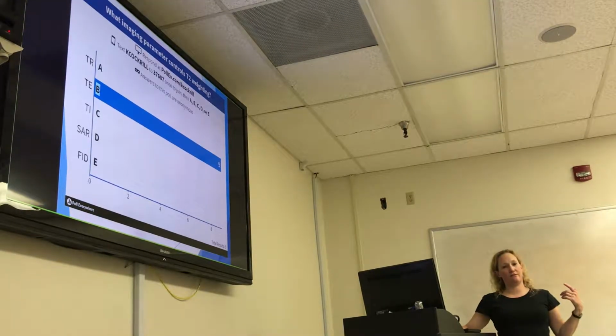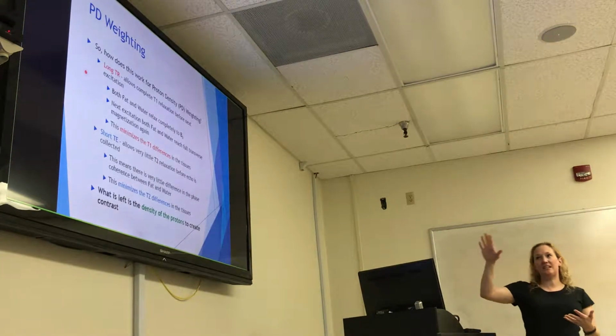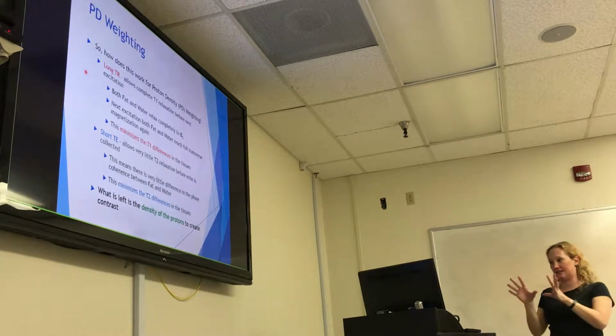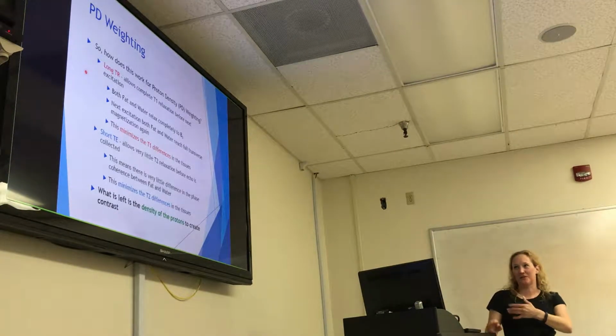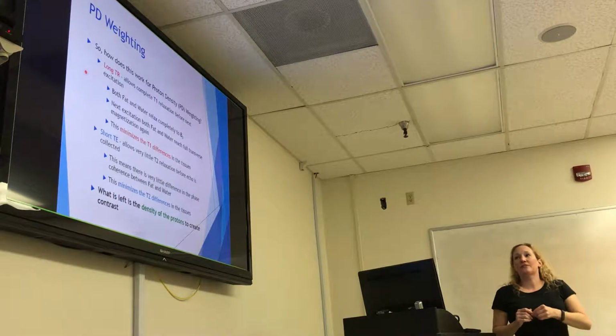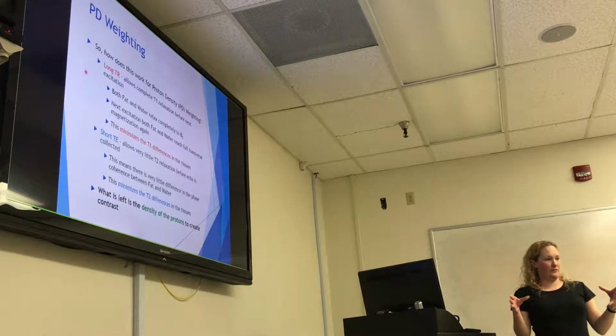All right, so we've got our T1 down, we've got our T2 down, and then we've got our third type of image weighting, which is our PD, or proton density, okay? The question from the homework, what is PD weighting? So we're gonna go into that now. So how does this all fit together with proton density?